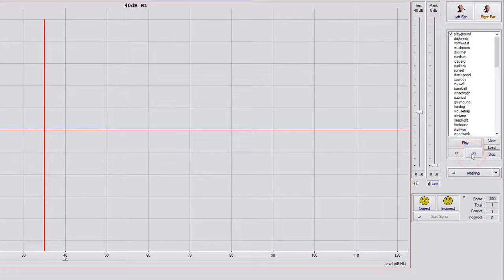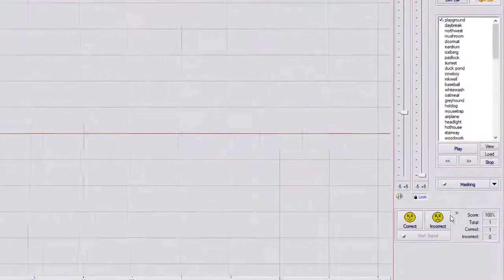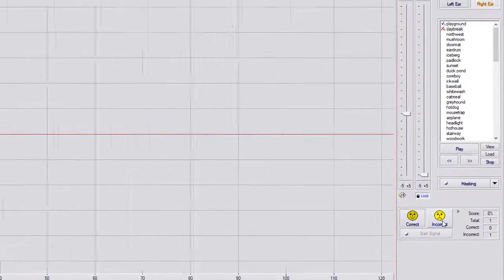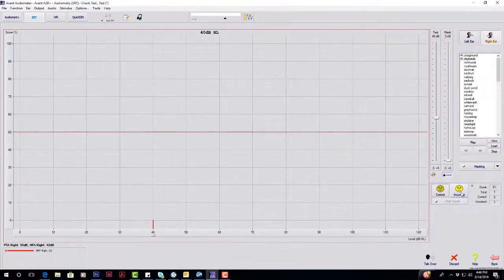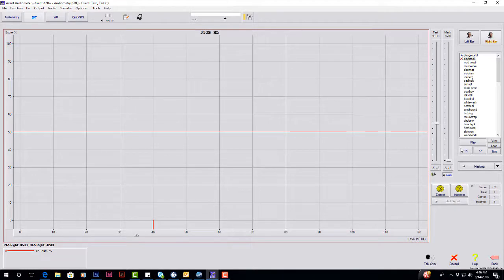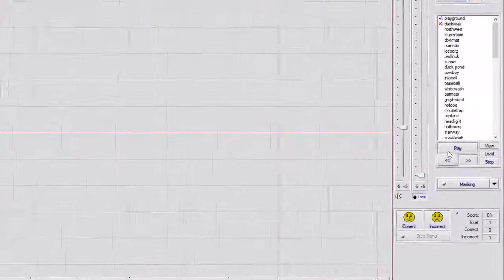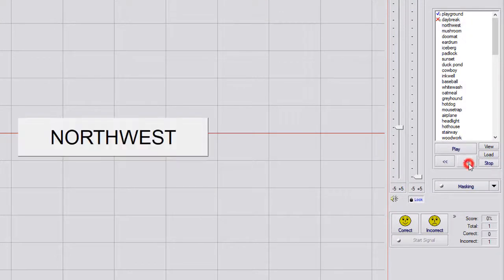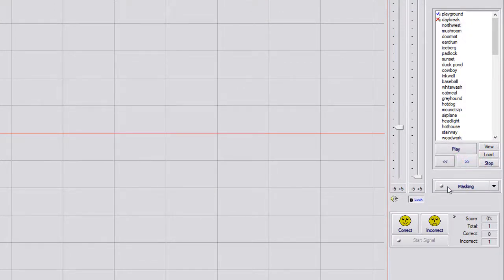It's going to say the word Daybreak. They got that one incorrect. You'll hit Incorrect here. Make your adjustment, and then hit the next arrow. Northwest. They got that one correct.